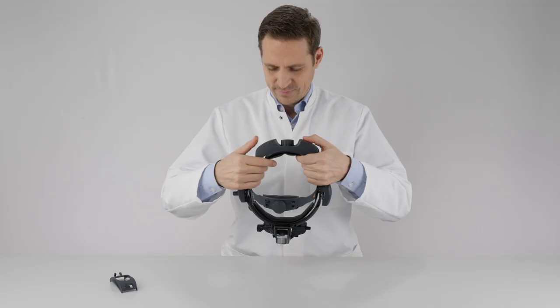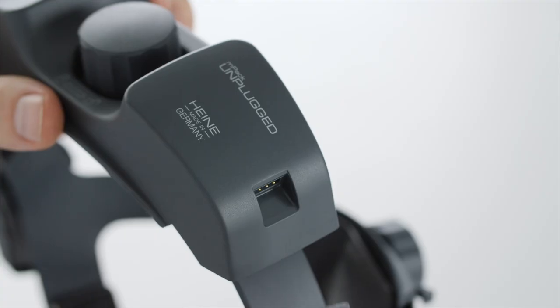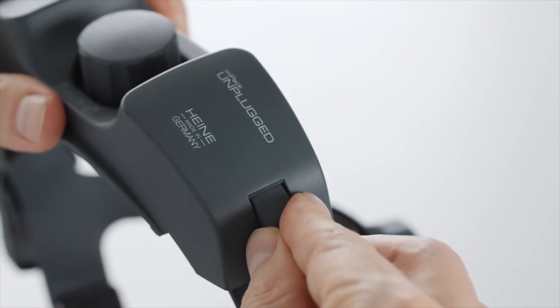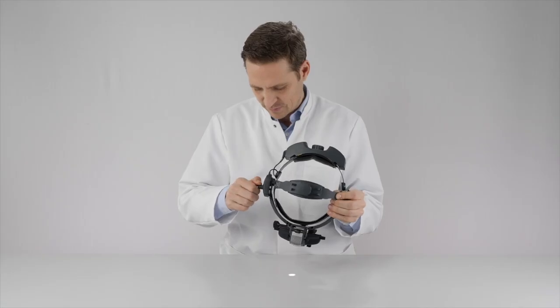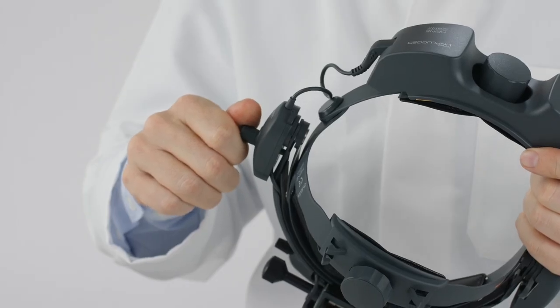Then attach the short connection cable of the brightness controller to the battery. Now the instrument can be switched on using the brightness control, and the brightness can be regulated accordingly.